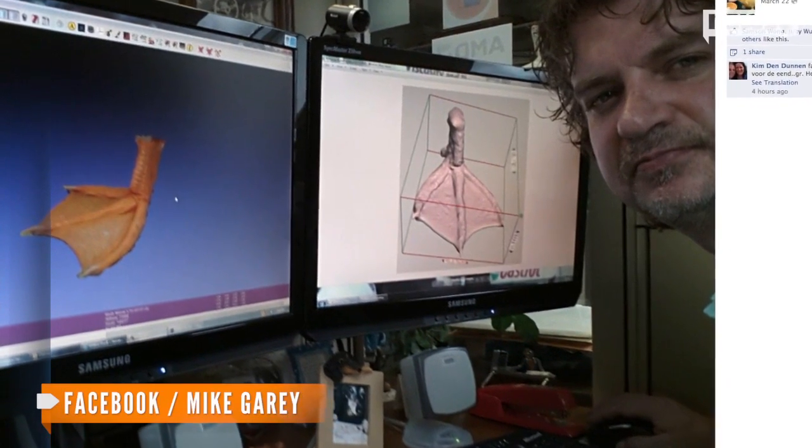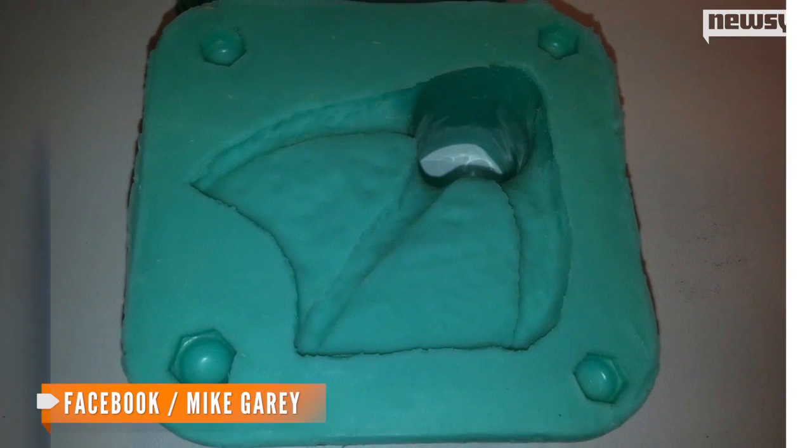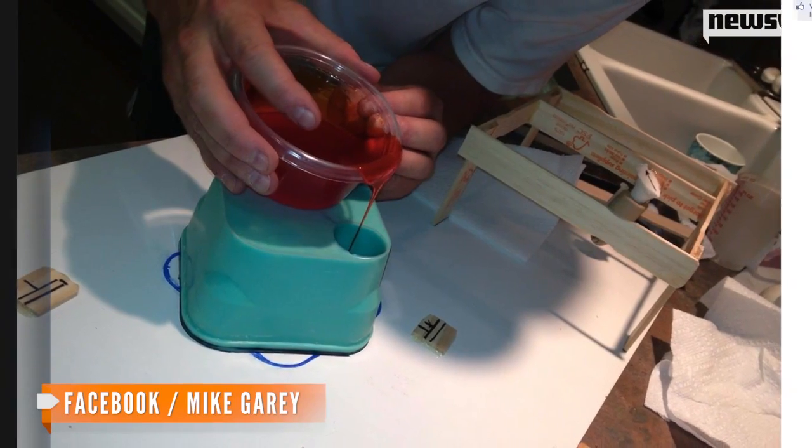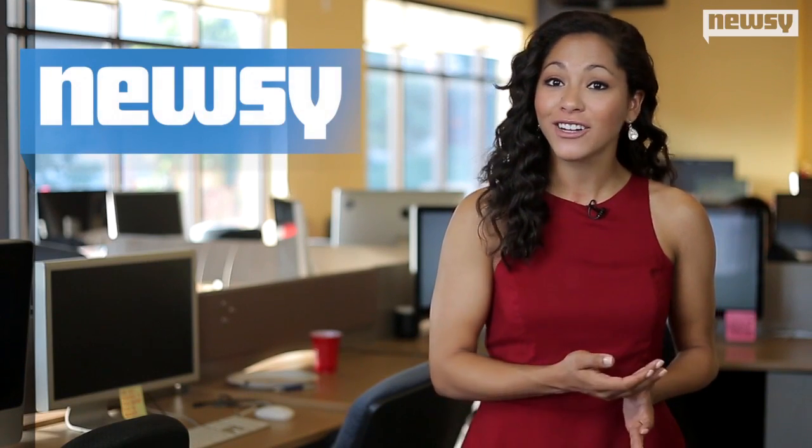The 3-D copy is made from hard plastic, so in order to get a silicone foot Buttercup can wear around, his owner Gary used a molding kit to come up with a softer version. He began the molding process on Saturday night, and it will have to sit for 16 hours. When it's finished, the prosthetic foot will slip on and off just like a boot.